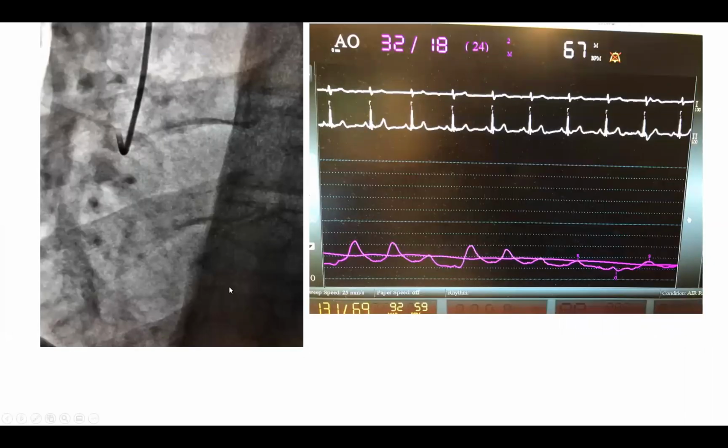Another idea before I move on to the guiding catheters is this, also very common. All the ideas I've described so far, except the left arising RCA, are very common ideas. So another very common idea is this. You're engaging the right coronary artery using a Judkins right, or even more commonly, this happens with a Tiger catheter. The catheter is looking like this, and this is what happens on your pressure recording. You remember, as you're engaging, you're always looking at your pressure recording. So that pressure damped. What's your immediate next thought?